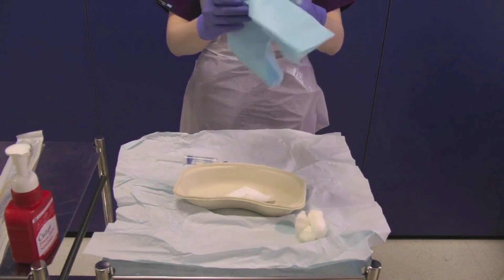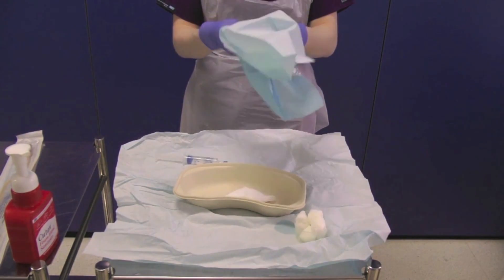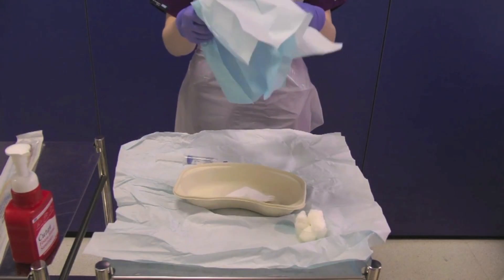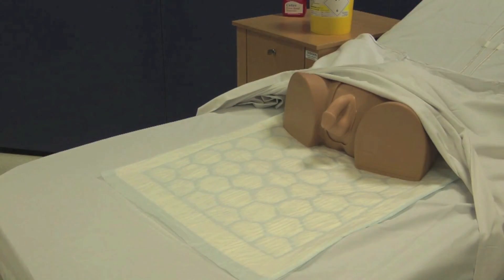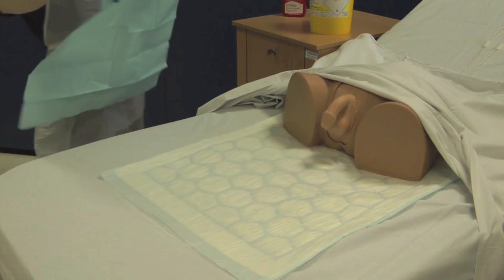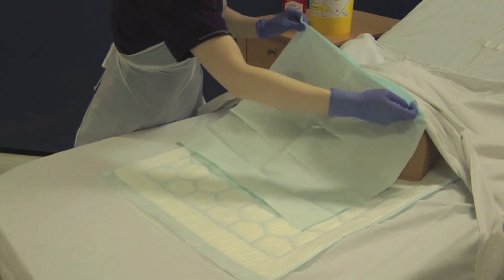Open out the sterile drape and tear a hole in the centre of it. Ask your assistant to expose the patient, noting the presence of the Incopad to prevent soiling of the bedsheets. Place the sterile drape over the penis.